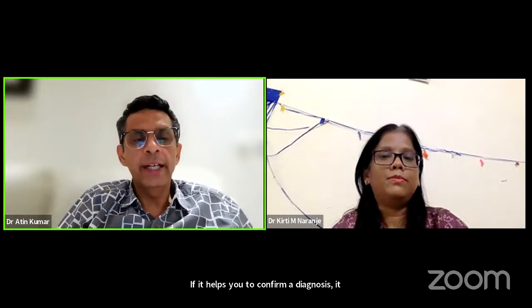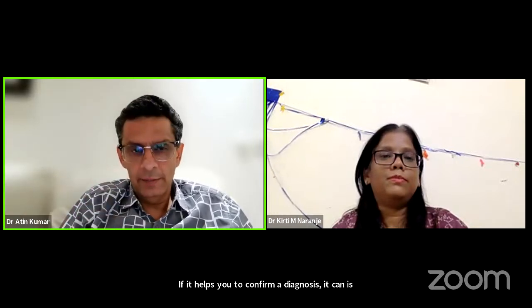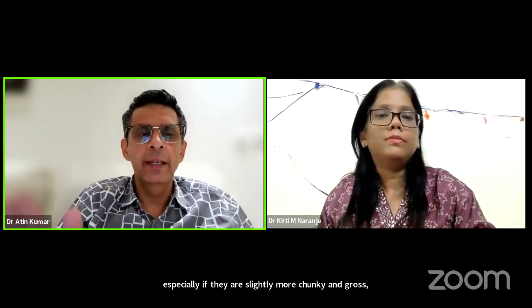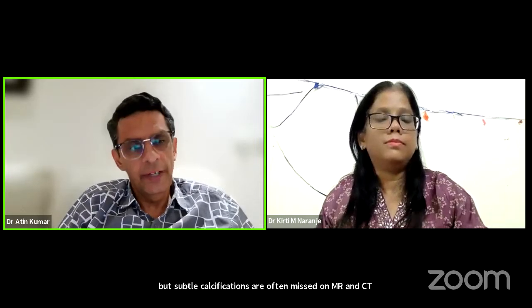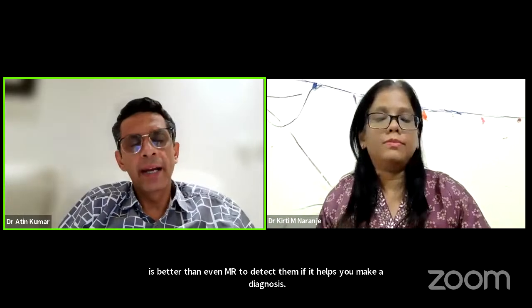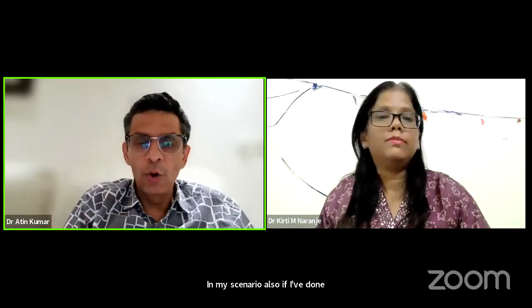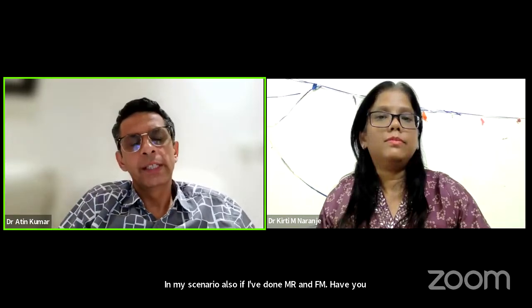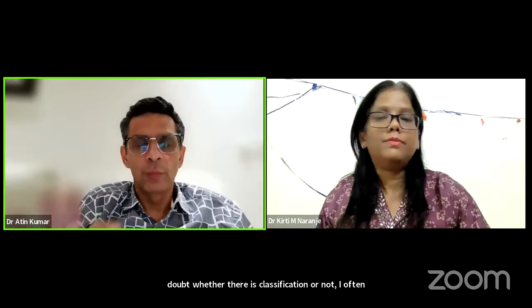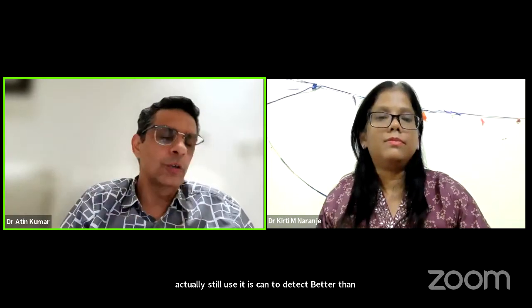MR can also detect calcifications, especially if they are slightly more chunky and gross, but subtle calcifications are often missed on MR, and CT is better than even MR to detect them if it helps you make a diagnosis. In my scenario also, if I've done MR and I'm having a doubt whether there is calcification or not, I often still use CT scan to detect calcifications. Better than ultrasound also. But if it is a dense calcification, ultrasound will definitely pick it up.